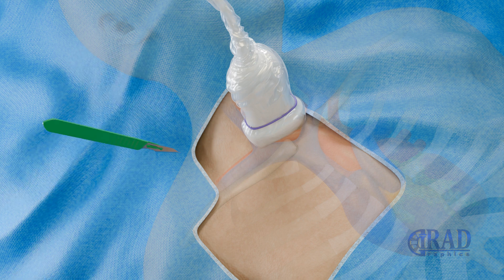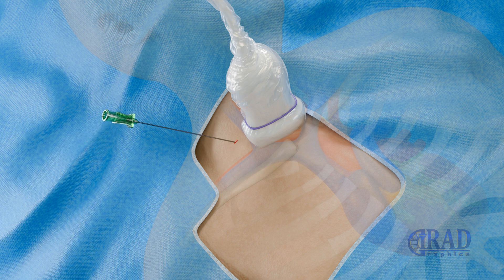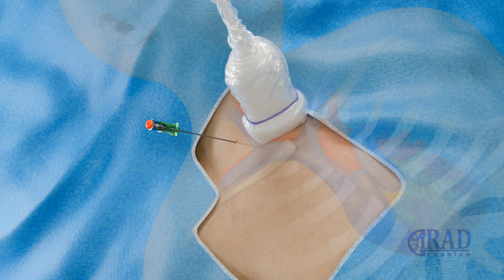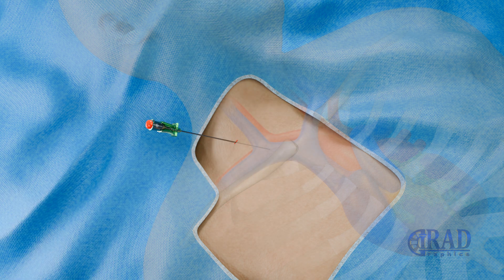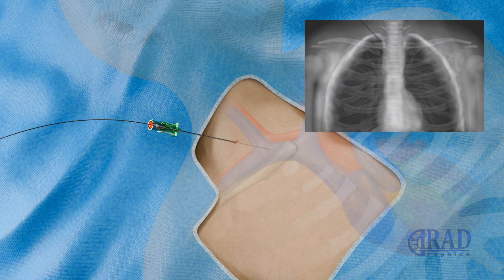A small incision is made at the chosen access site using a blade. A needle is advanced into the target vein under direct ultrasound visualization. Then a microwire is advanced through the needle into the vein.